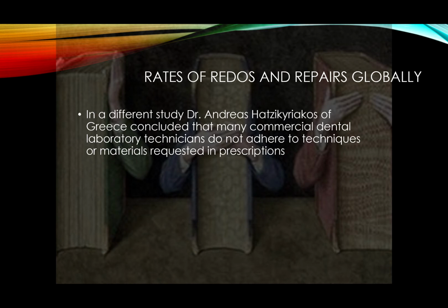The doctor supplied me with this photo to see that there's cervical staining. Okay, then it's A2 with cervical staining, and I see translucency, and I can mimic this translucency, and the photo is clear and everything is fine. So you mimic a little bit of translucency. You have to have information to deviate or to alter whatever the prescription is saying.